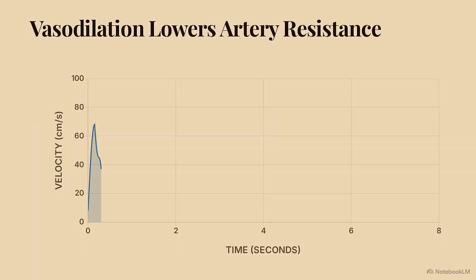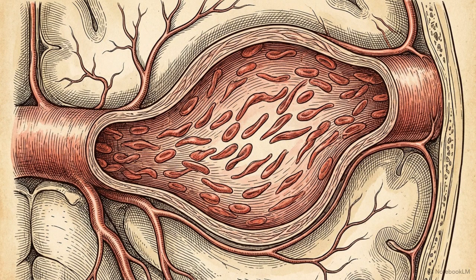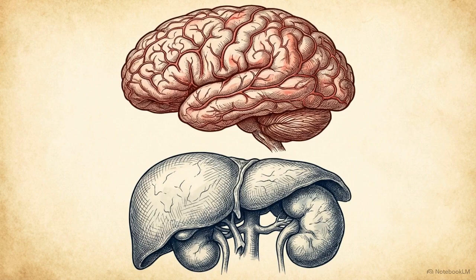This tracing shows the normal baseline state of a healthy fetal MCA, a strictly high-resistance vessel with sharp systolic peaks and very low diastolic flow. Watch the desperate vasodilation drastically alter the tracing. The low diastolic flow rises significantly, dropping the overall resistance. Clinicians frequently observe an absolute increase in peak systolic flow at this stage, a final hemodynamic warning that often precedes the onset of fatal hydrops. High diastolic flow in the MCA is not an indicator of healthy brain activity. It is evidence of systemic prioritization, sacrificing growth to maintain oxygenation.